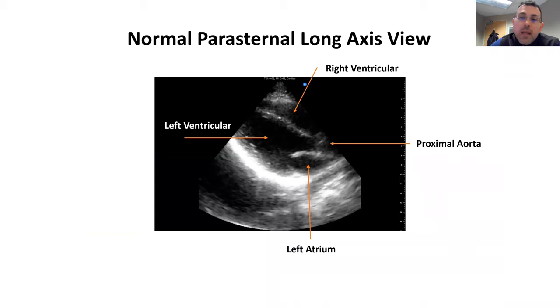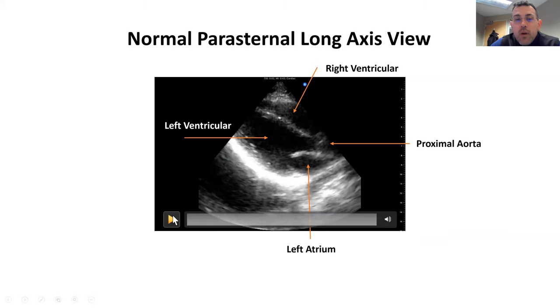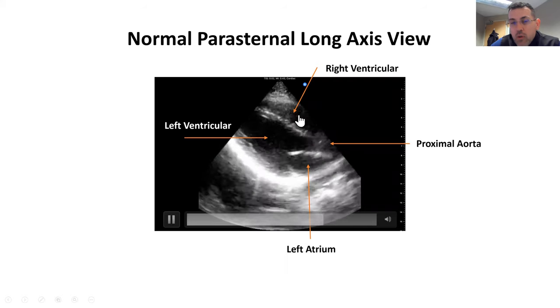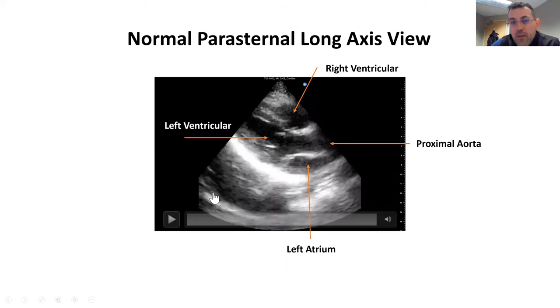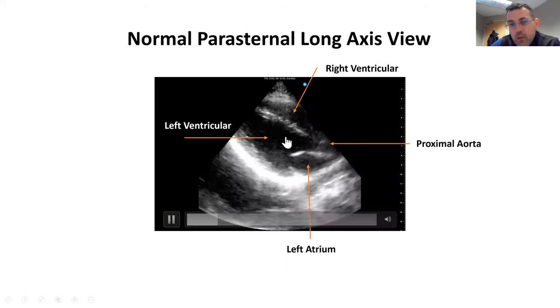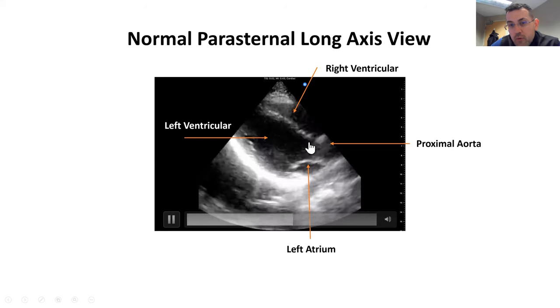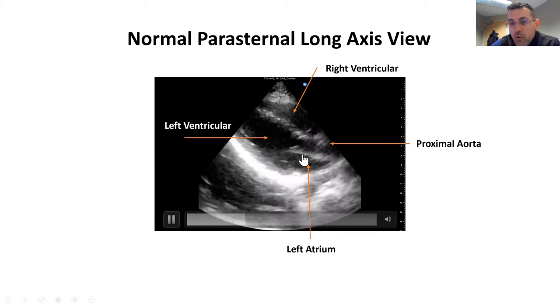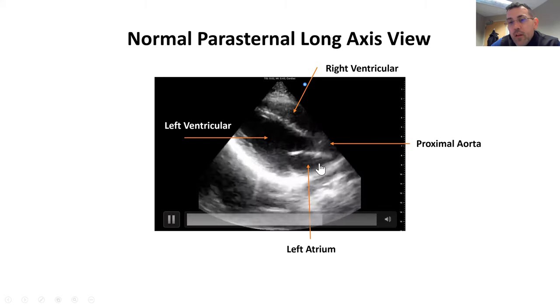Here we obtained our probe positioning between the second and the fourth intercostal space on the left side of the sternum. Running a clip, we can see up here our right ventricle, down here our left ventricle kicking out towards the left ventricular outflow tract. You can see a little bit of the proximal aortic valve, the proximal aorta, as well as the mitral valve and the left atrium.